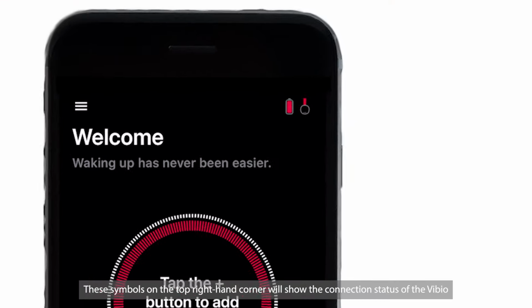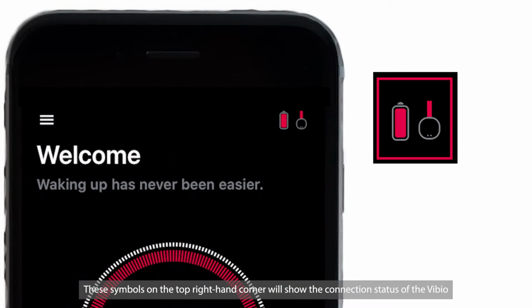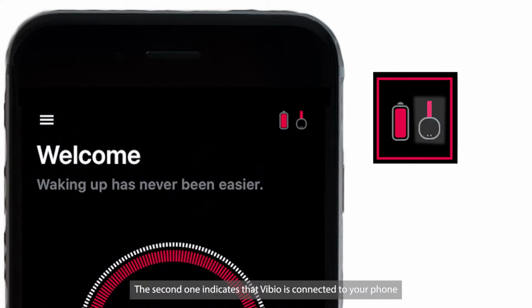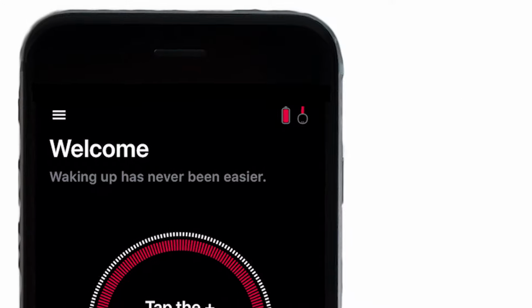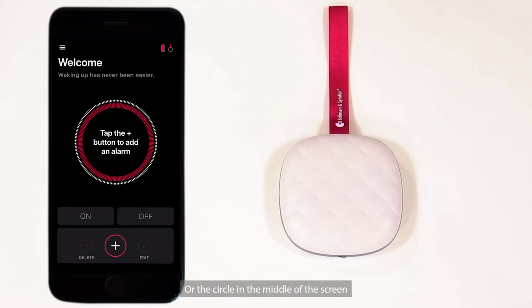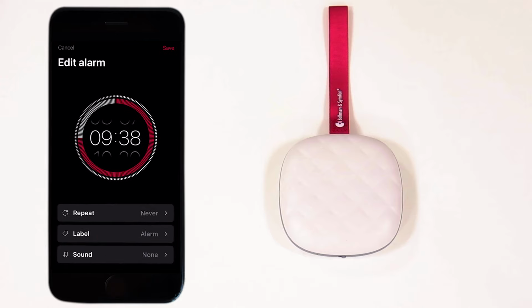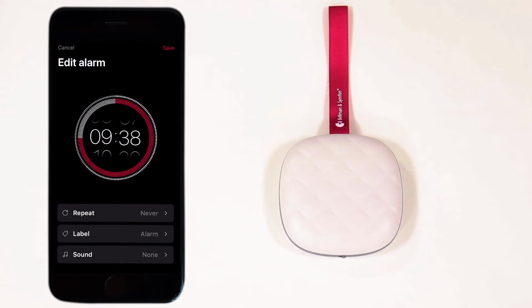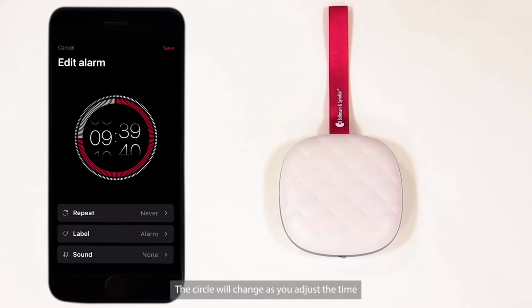These symbols on the top right-hand corner will show the connection status of the Vibio. The first one shows the battery level. The second one indicates that Vibio is connected to your phone. Now, to set an alarm, press the plus button at the bottom of the screen or the circle in the middle of the screen. This screen is where you will set and edit your alarms. To adjust the time, drag the numbers up or down. The circle will change as you adjust the time.